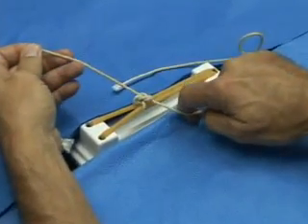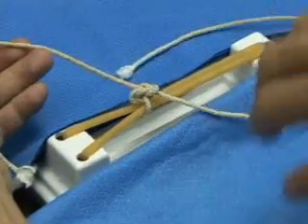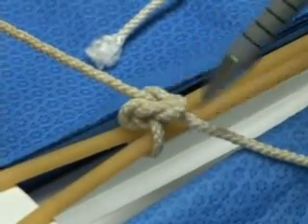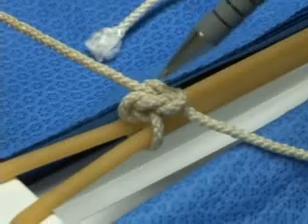And here goes another flat knot. If you look very closely, you'll see that in conjunction with the second throw of our first square knot, we've now created another square knot.